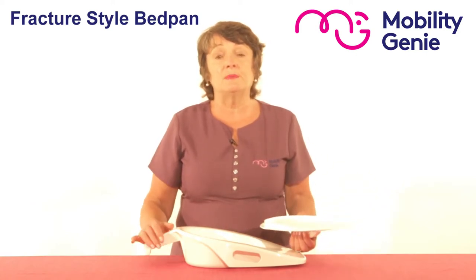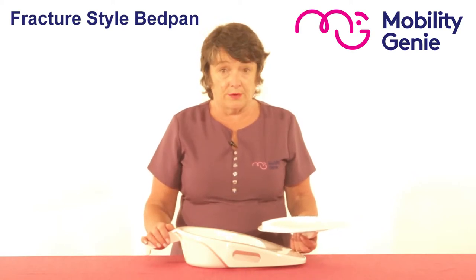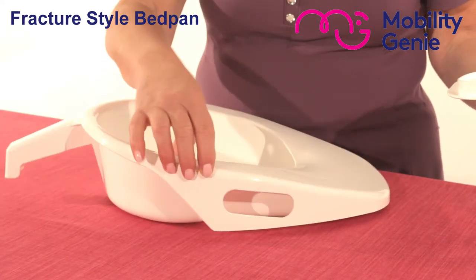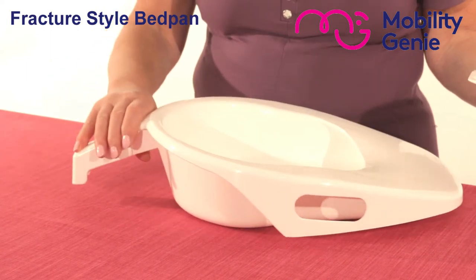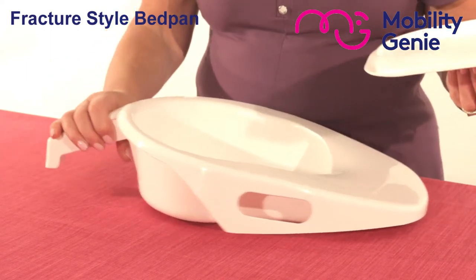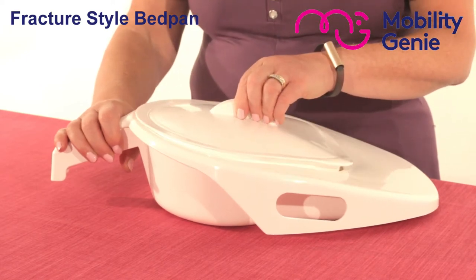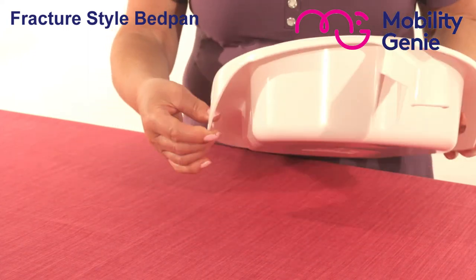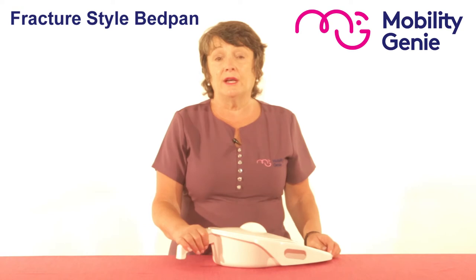Here we have a fracture-style bedpan. The old traditional bedpan used to be much higher and more difficult to use for one carer. With one side lower than the other, it's easier to slip it in under the bum. It's made from polypropylene and you can get it with or without a lid. The side handles and the end handle make it very easy and comfortable to use.